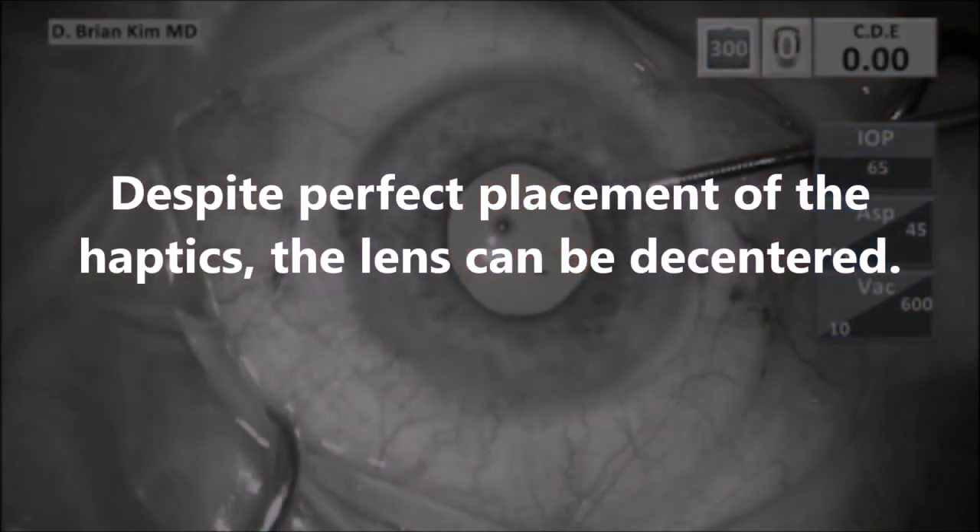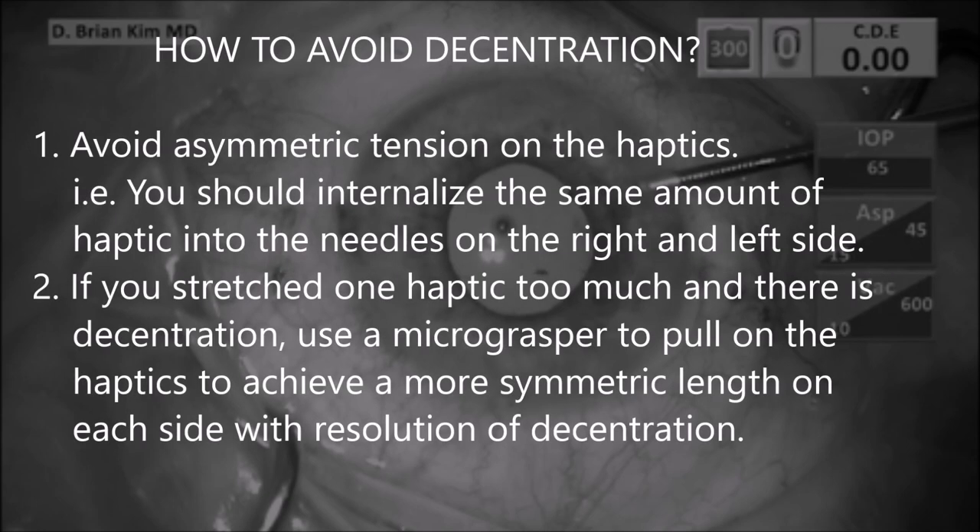So despite following perfect technique and perfect placement of the haptics, the lens can still be decentered. To avoid decentration in this situation, avoid asymmetric tension on the haptics. In other words, you should internalize the same amount of haptic into each of the needles on the right and the left side. In my case, I put too much internalization of the haptics on the right needle and not enough on the left, and that caused asymmetric tension.